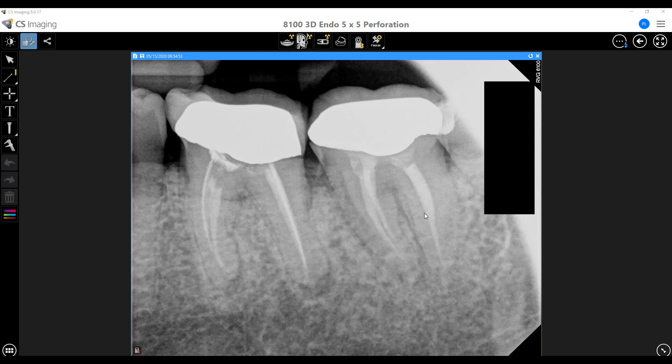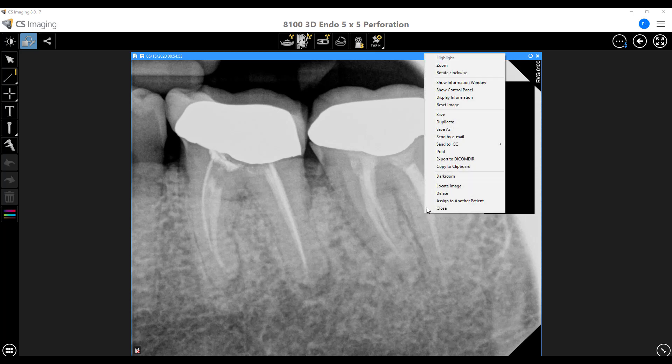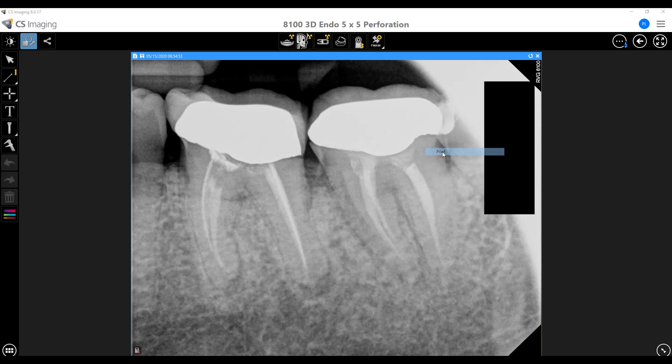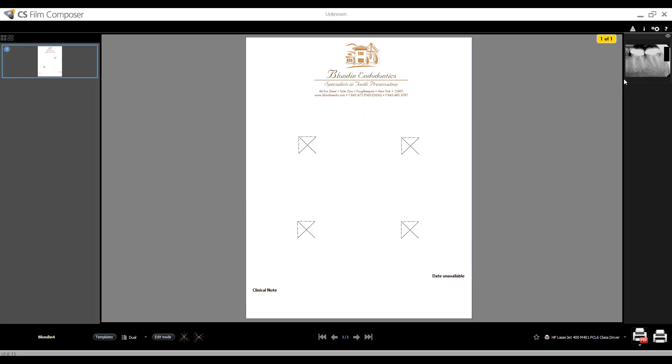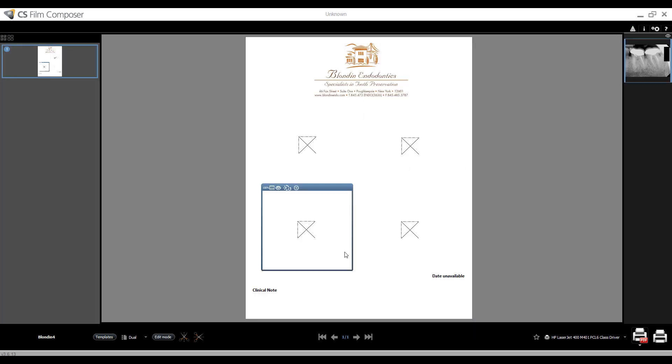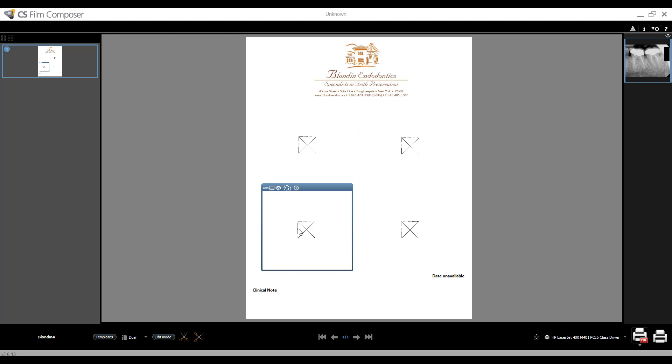A couple other things you can do. So let's launch the template again. Let's go ahead and drag our PAs. Actually, let's first take a look. We've got four boxes. So I have four images I can actually select and add to this report.